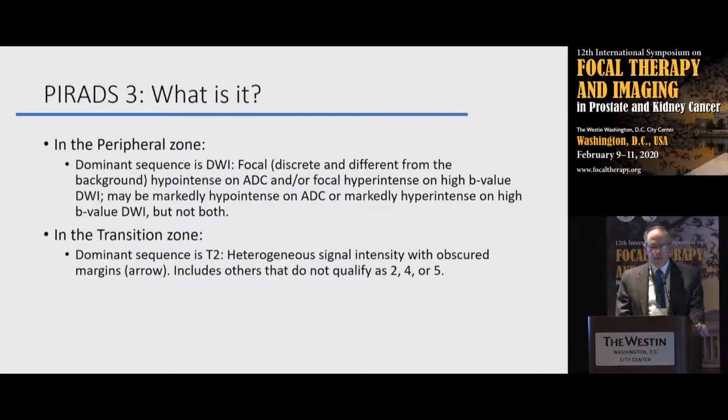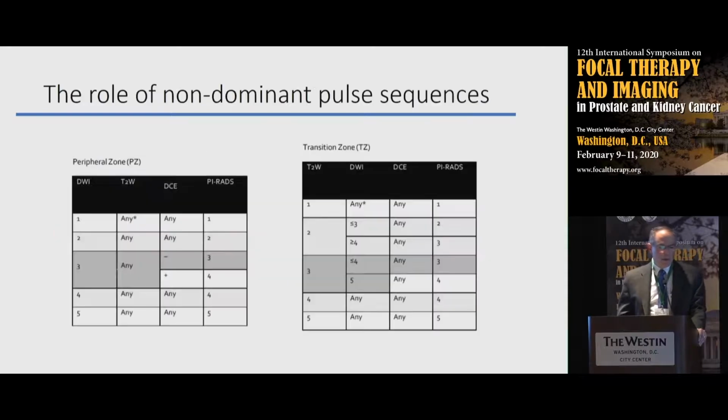So the first point is that PI-RADS is not a blood test. It doesn't yield a result with super high reproducibility, and people perform at different parts of the ROC curve. And that's going to change the outcome for different places. This is also a chart from PI-RADS v2.1.